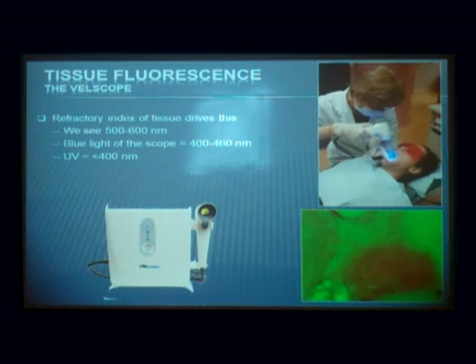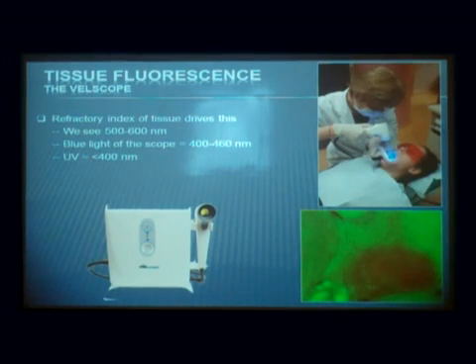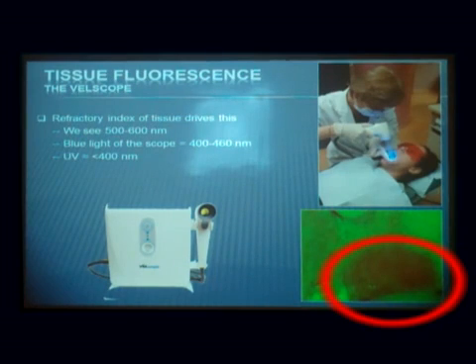Well, at any rate, the light is about a four-foot fiber optic cord, so you're kind of tied to it. And then it shines this blue light directly into the mouth. Some goggles are on, but not really necessary because this is very safe technology. And then the doc looks through the eyepiece and looks for dark areas. And any dark areas, the darker it is, then that means this is a cell that doesn't glow. And it turns out that immature dysplastic cells are the ones that don't glow. So this is an area, it's been FDA approved actually, for margins. They biopsied across the margin from the green to the black, and the dysplasia stops at that line. It's pretty amazing stuff, but there are still some downsides to this.